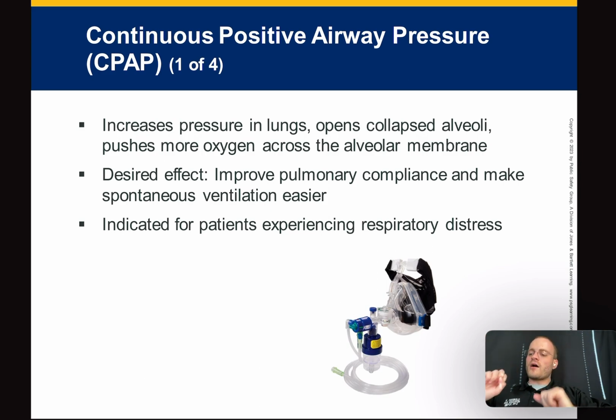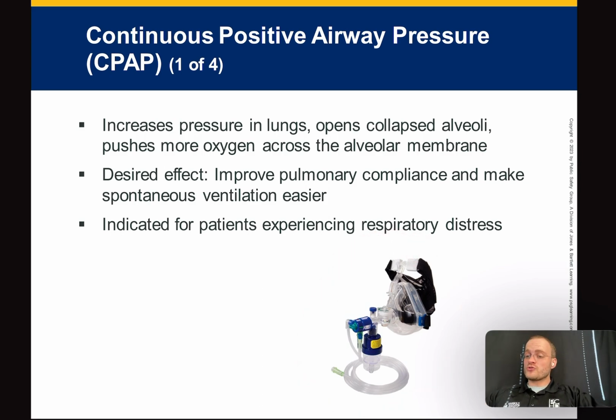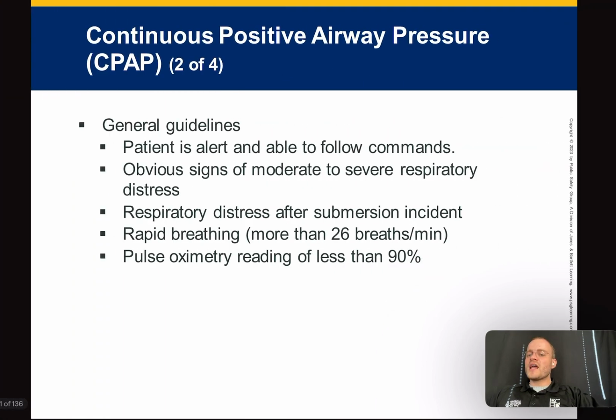Okay. One thing I'll add about CPAP that I told you is remember those who have obstructive sleep apnea, those who snore or quit breathing in their sleep, they sleep with CPAP. So you will see patients that sleep with this. So it's indicated for patients with respiratory distress. As a general guideline, patients that get CPAP need to be alert and able to follow commands. Okay. They need to be in pretty good respiratory distress. So this is kind of one of the big guns, okay, that we pull out in the more severe cases.